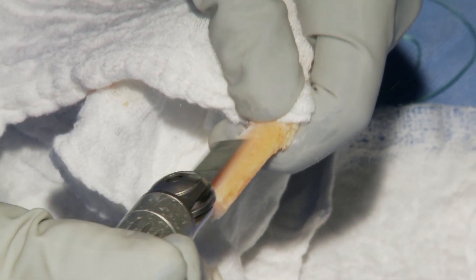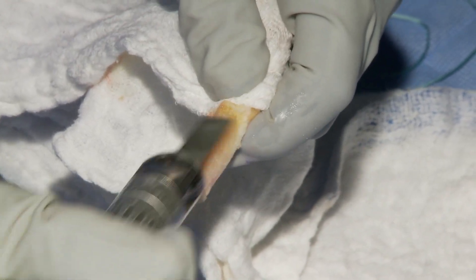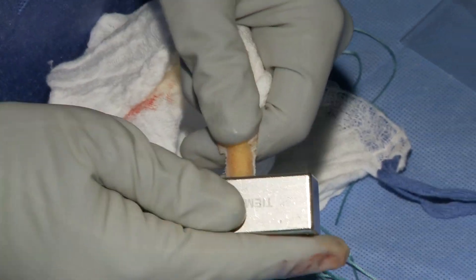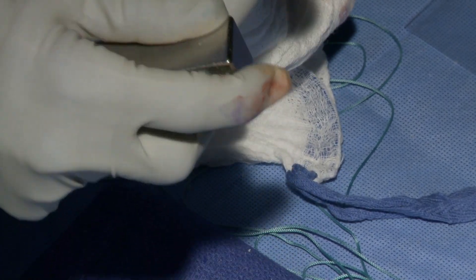You make sure that it fits into whatever tunnel size you have decided on with the attending — generally it's a 10. I like to use a ronger to remove any excess bone, or use Metzenbaum scissors and trim it so that it can fit perfectly into the 10mm sizer.